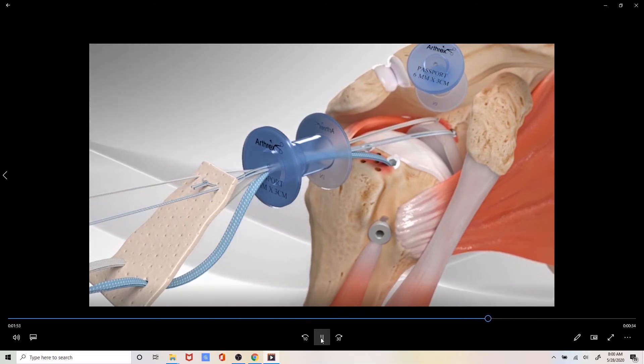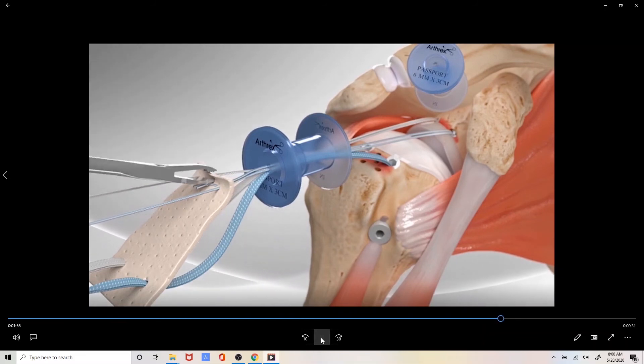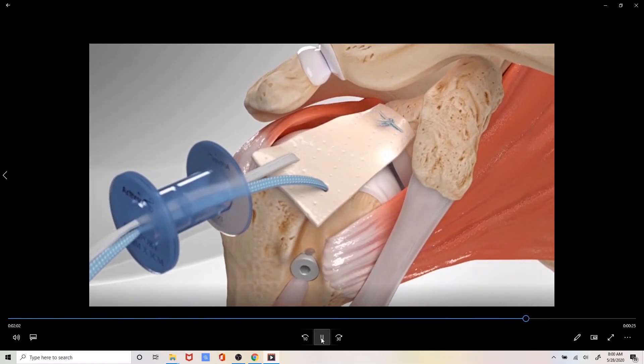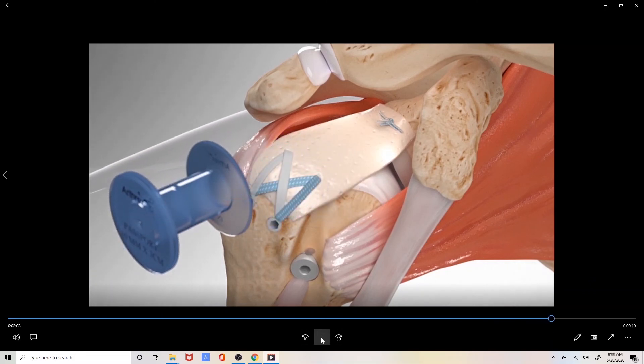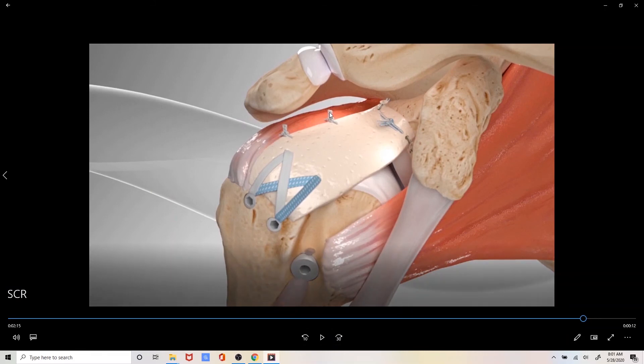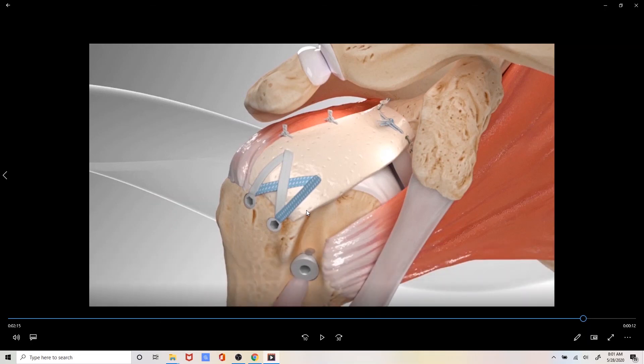We will then pass the graft through the portal arthroscopically and into the shoulder joint, where the graft is then tied down to both the socket as well as to the top of the ball. We will then incorporate stitches into the back of the graft in order to incorporate the remainder of the rotator cuff into the SCR graft. This is the final product, and you can see how the superior capsular reconstruction graft has now covered the previous hole or gap in the rotator cuff tendon up top.